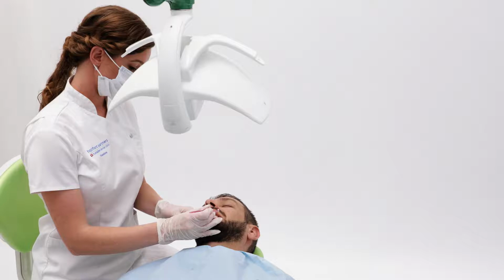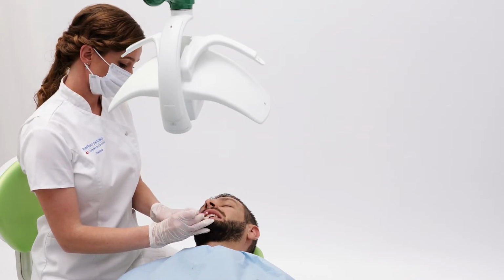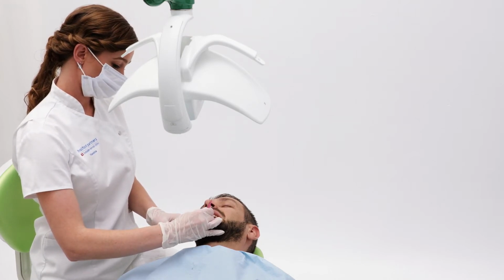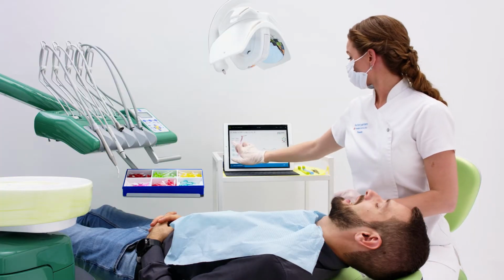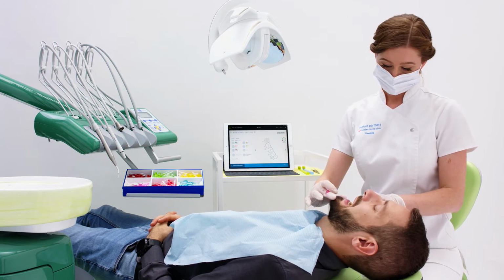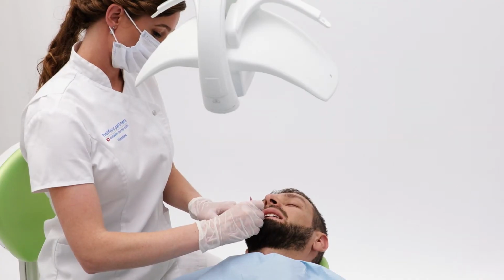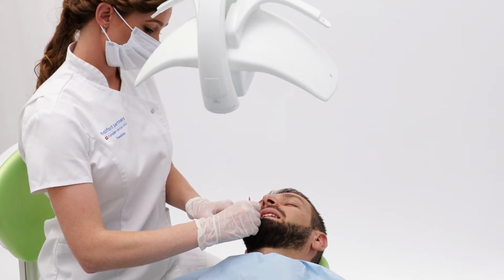When using the IAP on the lower anterior sextant, it clearly indicates the colour turquoise on the probe for each interdental space here. I input this information into Bob by holding down the turquoise button, which then infills each interdental space with turquoise. I complete my IAP full assessment on Edward's lower right sextant.